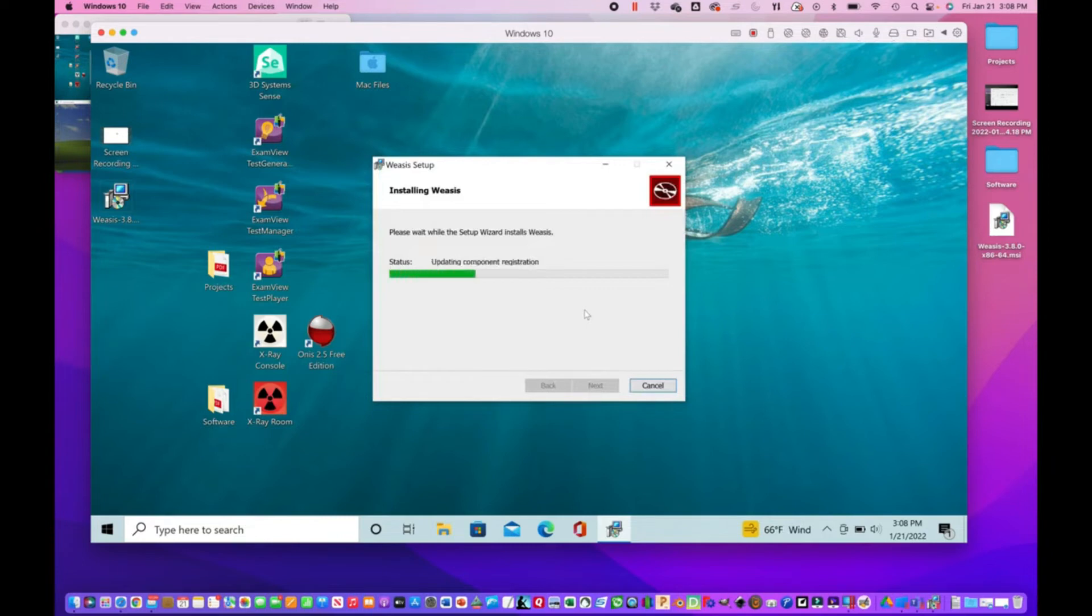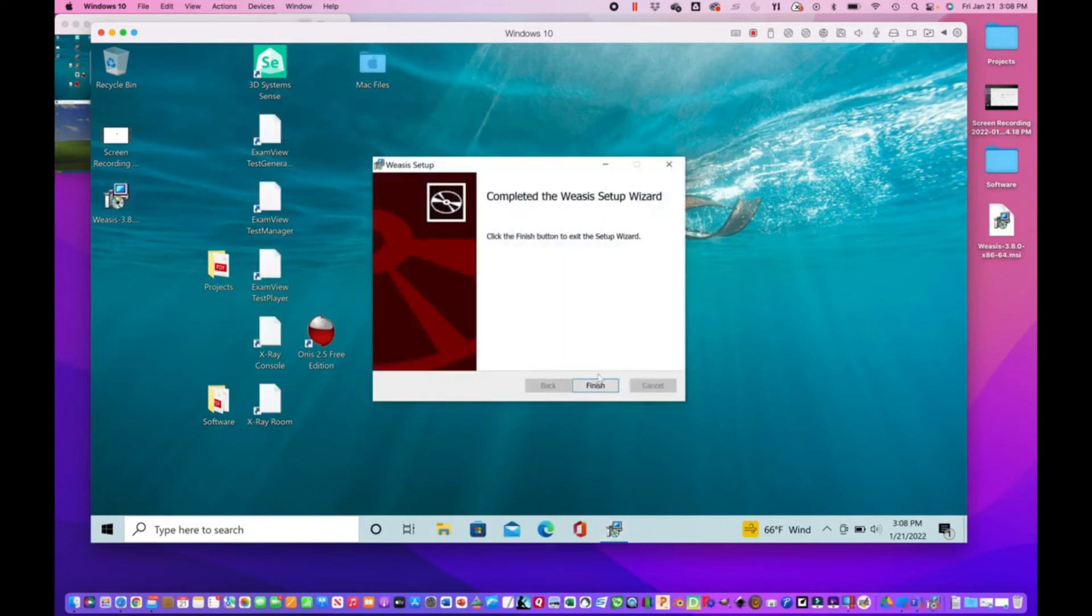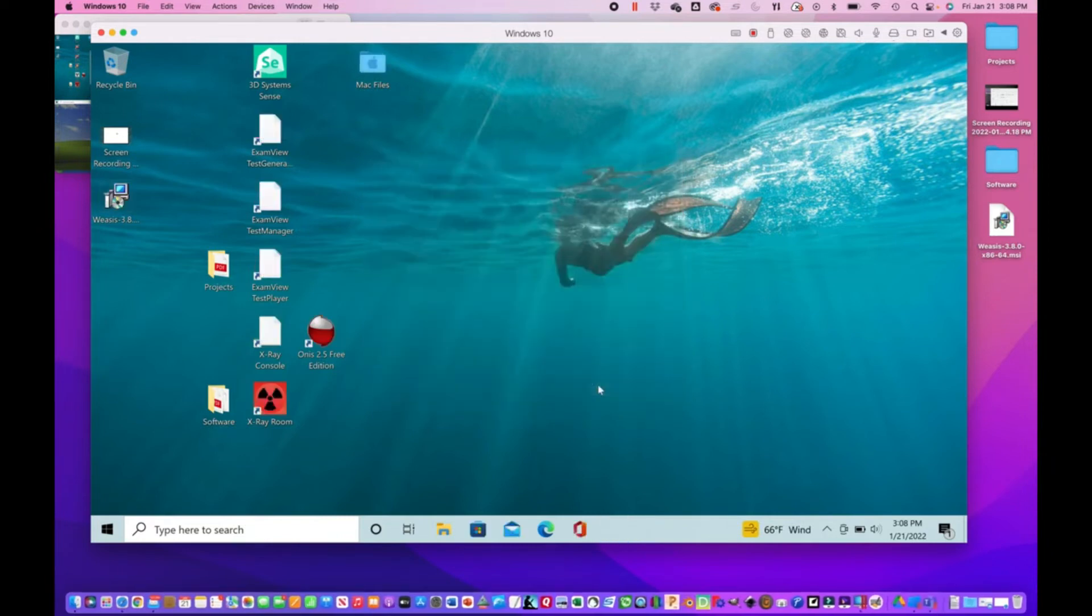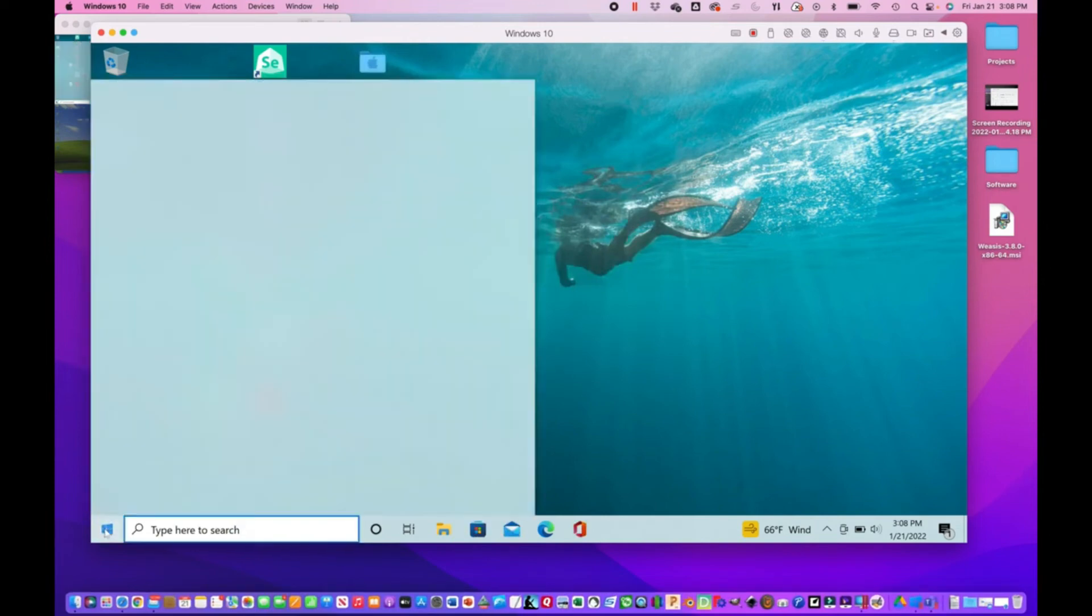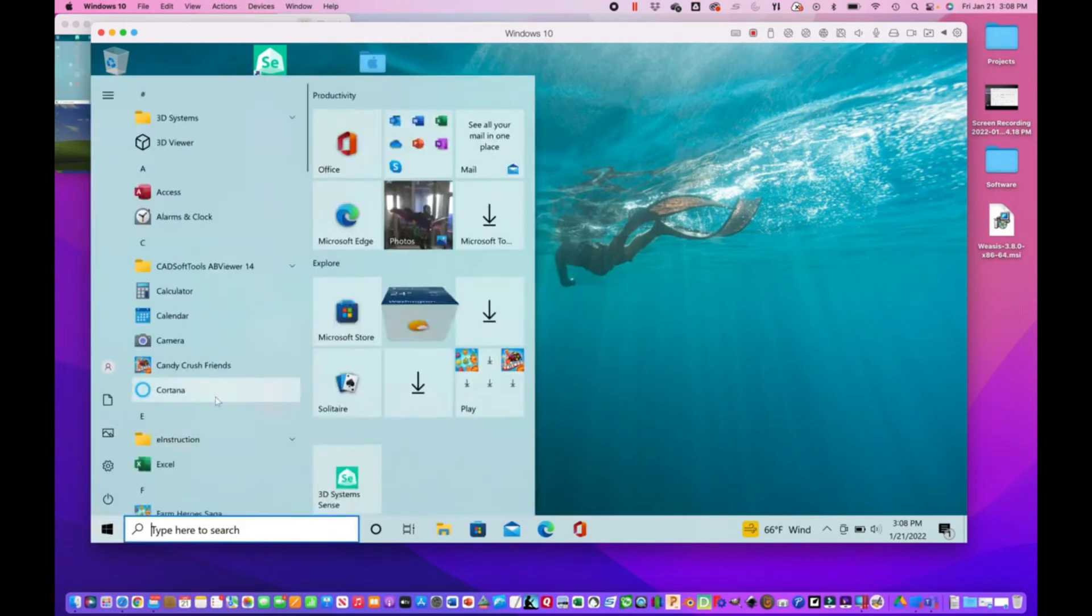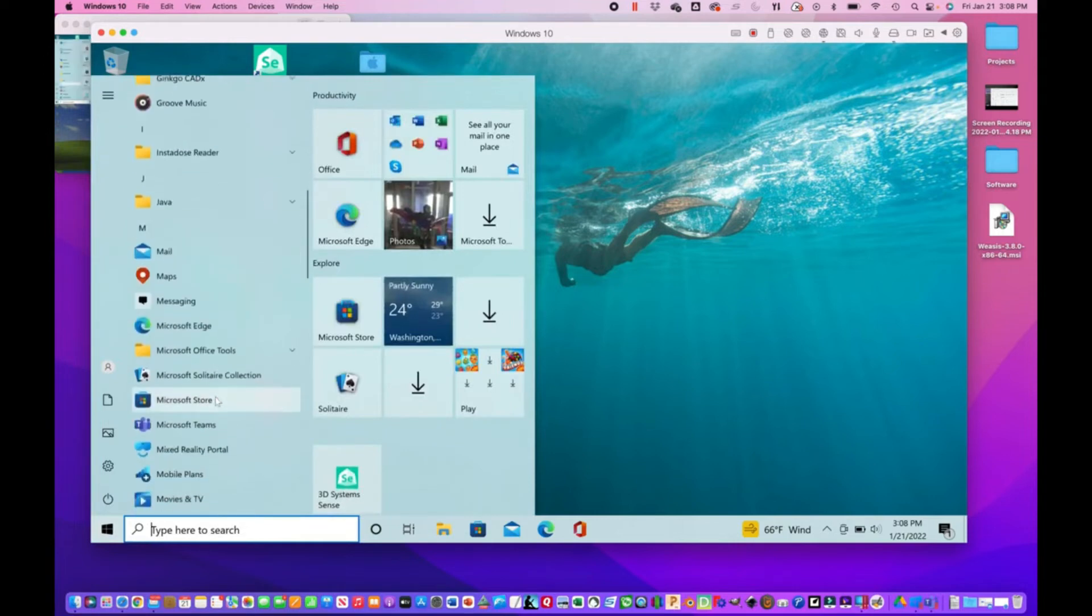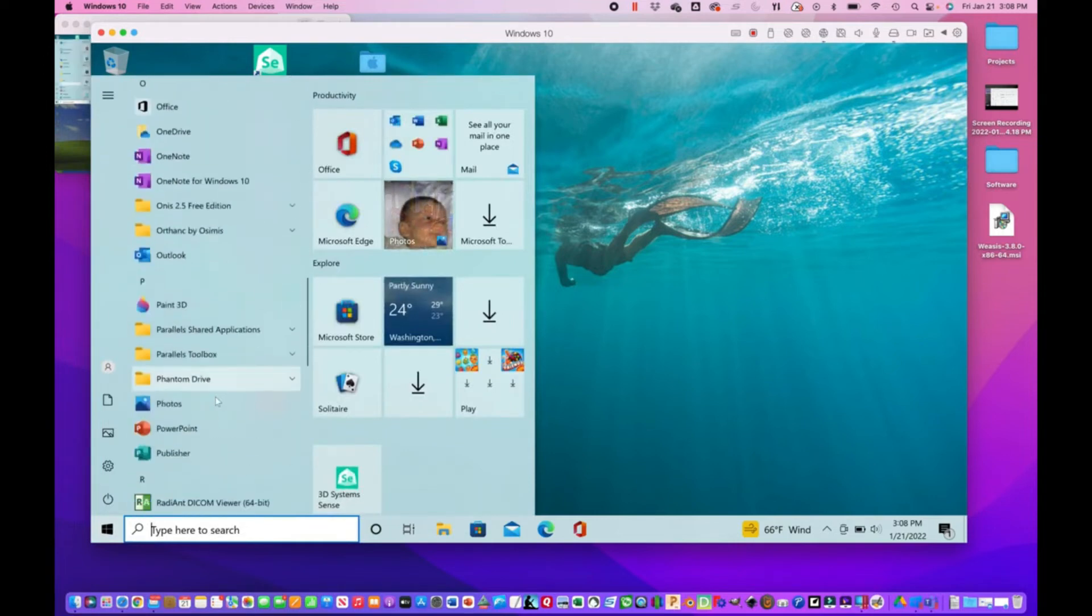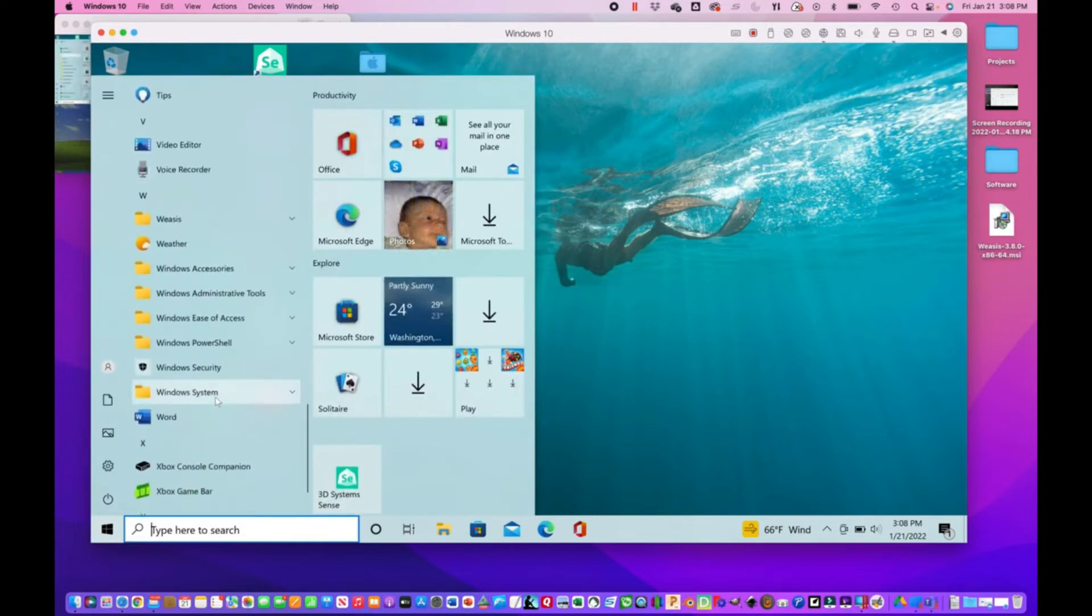Say yes to that. All right, that's it. And of course, just access it just like any other program from the start menu.